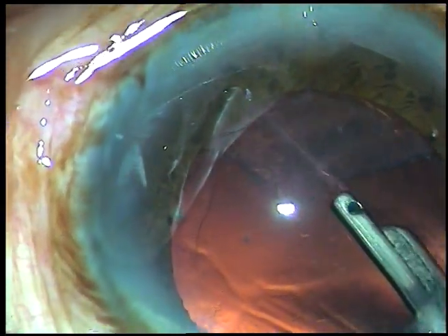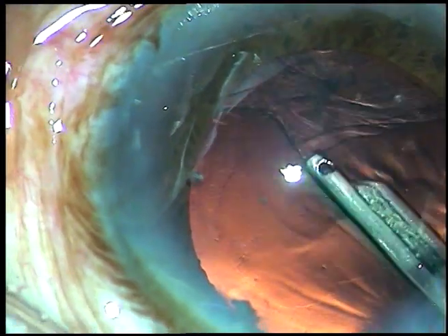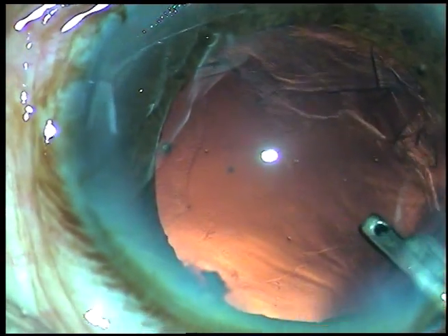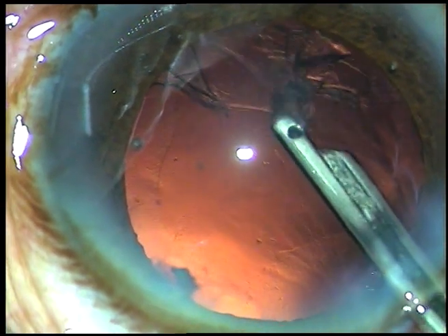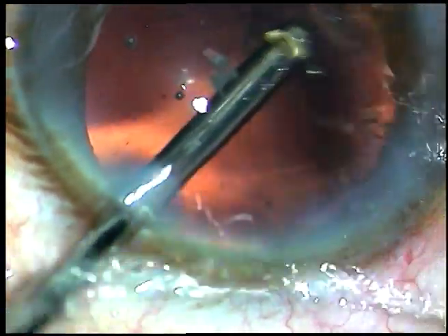After removing the cortex from all these areas, I go to 6 o'clock and here I find that these are vitreous strands. If I pull these vitreous strands, I am going to cause a lot of damage to the vitreous base and there can be a peripheral retinal tear. So I regurgitated whatever I was trying to aspirate, flushed it out, and came out.